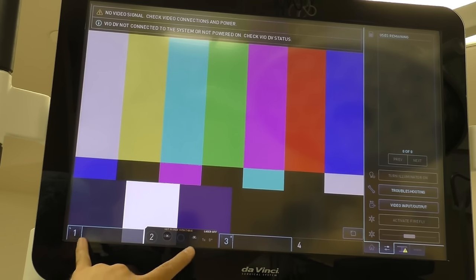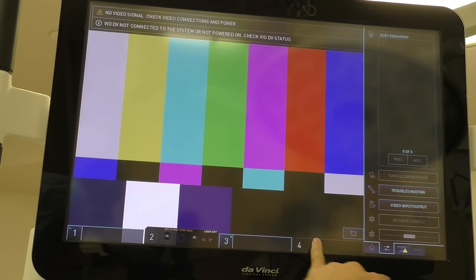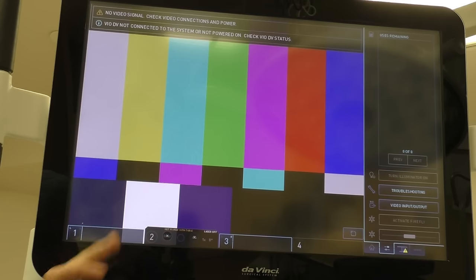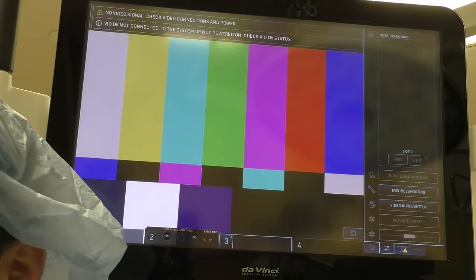Down here we have four little bars — these four bars are actually the arms. What's great about this is when you have instruments in these arms, it'll tell you exactly what instrument is in each arm or camera, and which arm it is in. So that was a lot of info on a brief overview of the three main console units attached to this DaVinci robotic system.